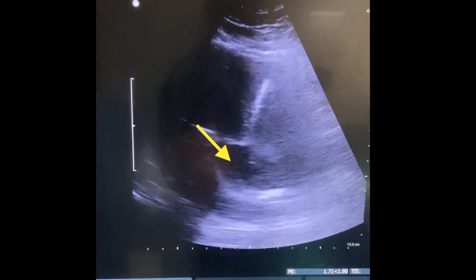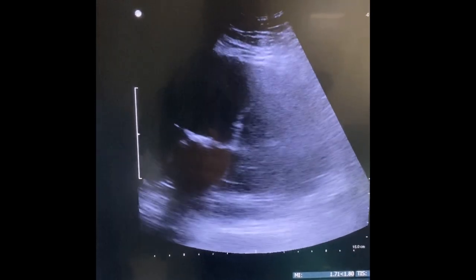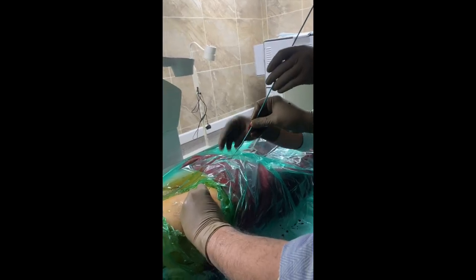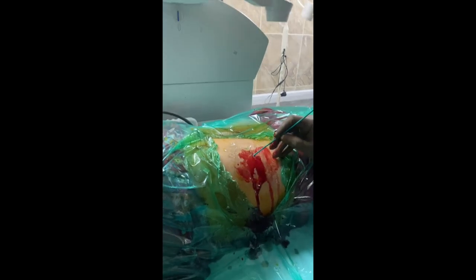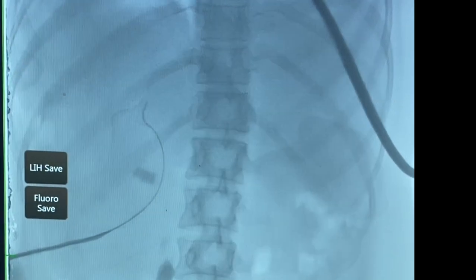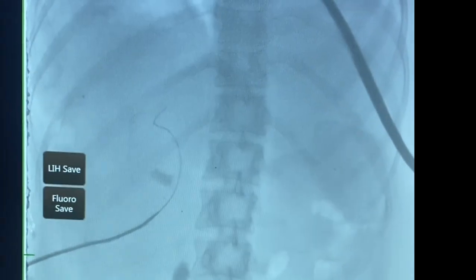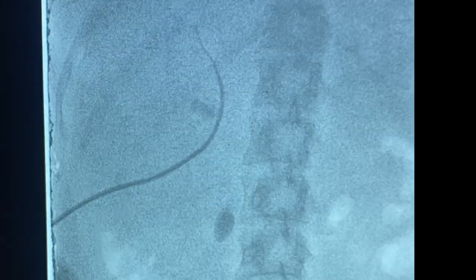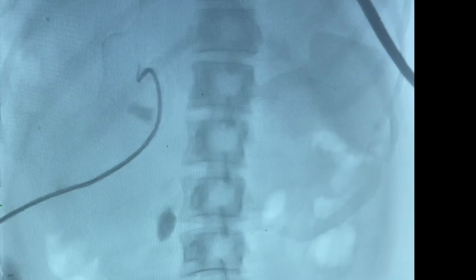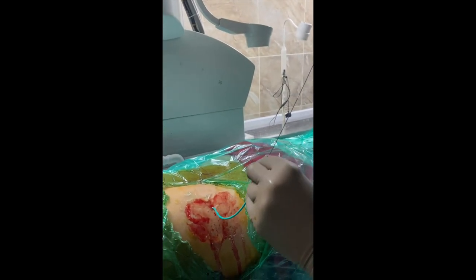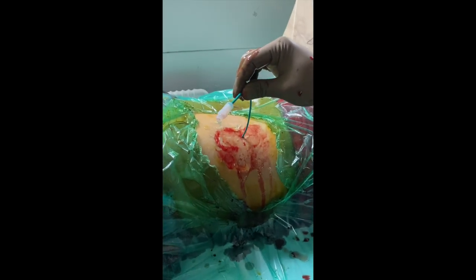Once dilatation is complete, the position is reconfirmed with ultrasound. An 8-French pigtail catheter is then slowly advanced over the guide wire using a rotating movement. It is very important to keep the guide wire stable while pushing the pigtail catheter into the system. When the catheter coils within the system, the guide wire is removed and free flow of urine confirms that the pigtail is correctly in place.